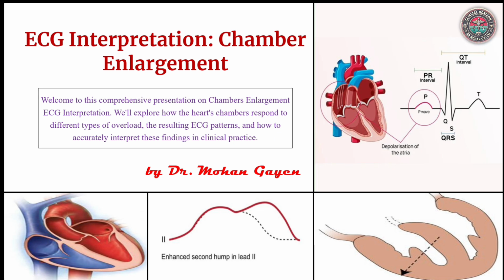In this session, we will explore how hypertrophy and dilation reshape the heart's electrical landscape and how to detect them early for timely intervention.